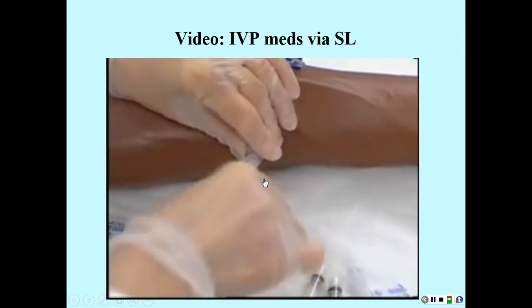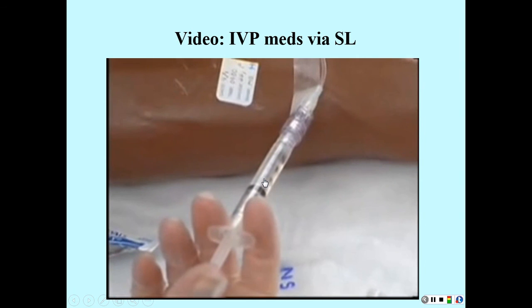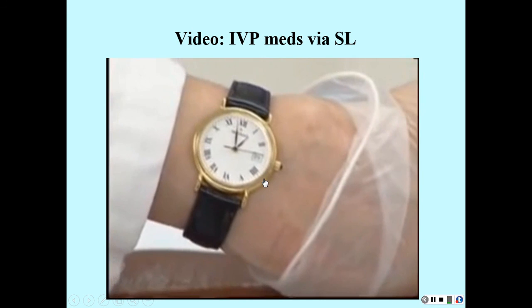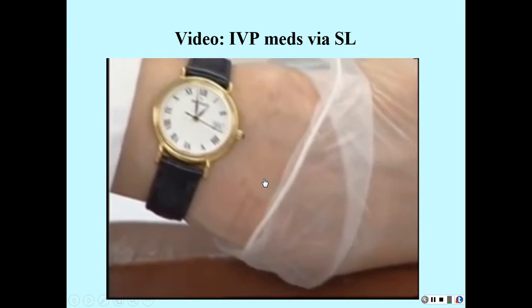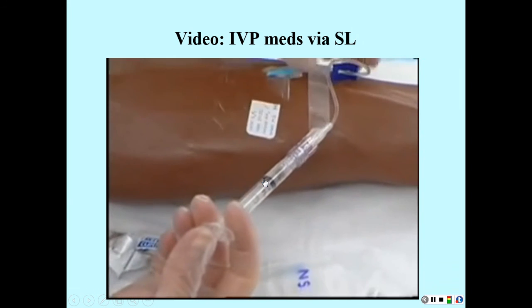If using saline lock with extension tubing, flush with same amount of fluid at same rate as medication to prevent bolus of medication. If more flush is necessary, inject slowly and steadily.